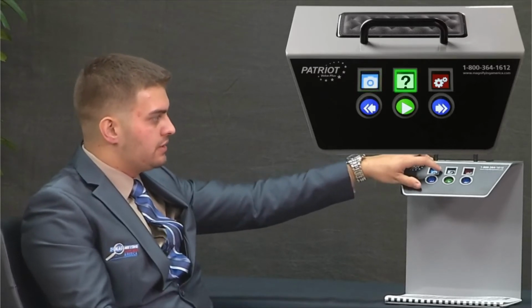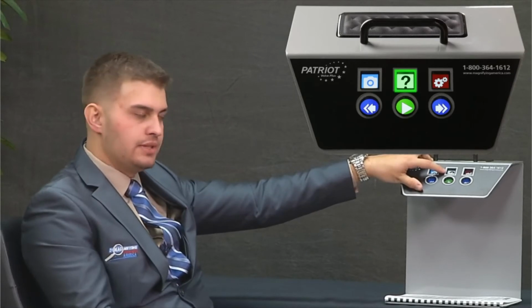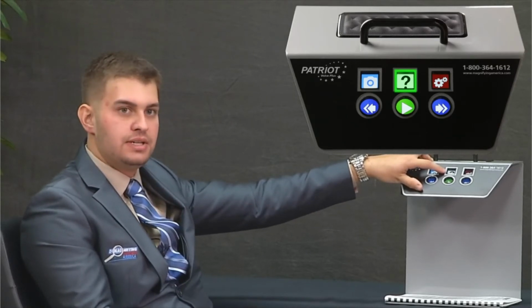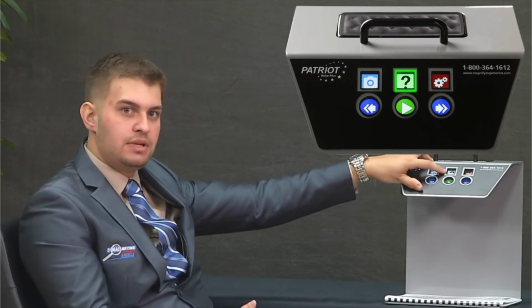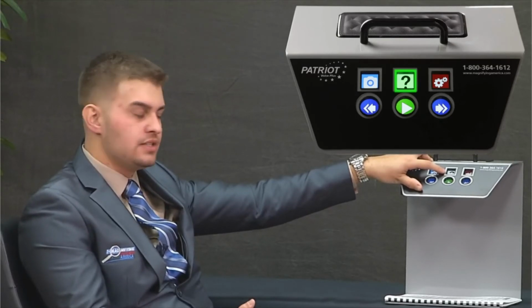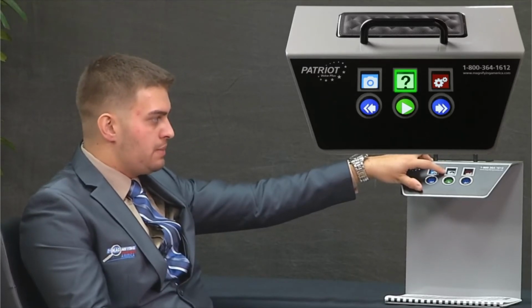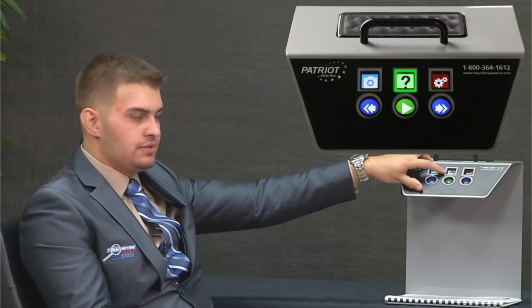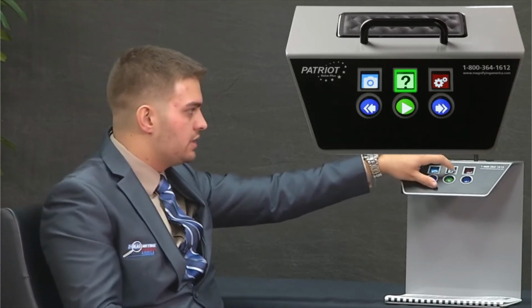The last button, one of the coolest if you ask me, is this top middle button, which is the question mark. What this does is it's Alexa built onto it. So when you hold down this button, you could actually ask it questions like what time it is, what's the weather, what's the date today, and so forth. When you hold it down, you're going to hear command please with a short beep after that. After that beep, it'll start recording your voice, and then you could ask it what you want. So I'm going to test it out on a question here.